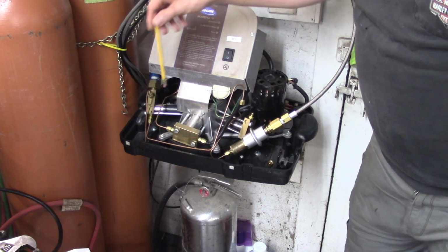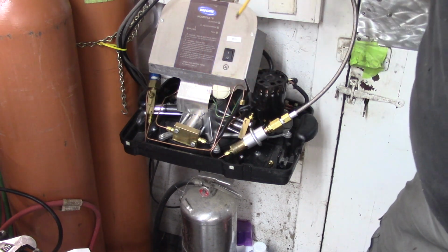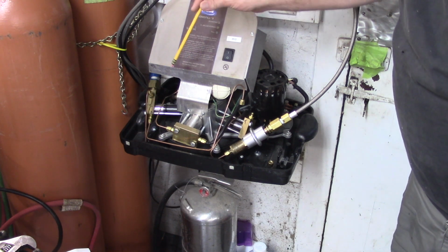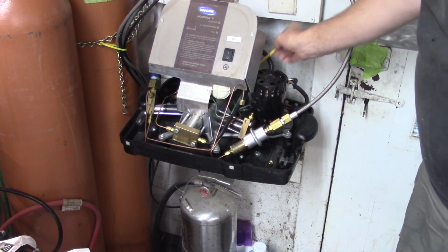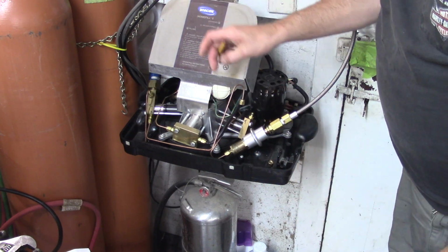Okay, so you cannot see the other two cylinders in the video. But those are, I don't want to say they're unimportant, but they're actually the most important ones because those are the ones that we're using. But cylinder number 1 is all the way back here on the back of the machine, and it's pretty large in diameter. It's about 2 inches in diameter. Again, I did not check the bore size on those. I did not take those apart.